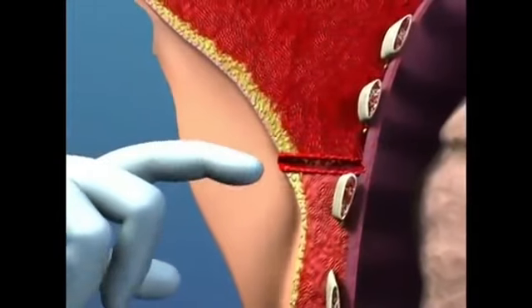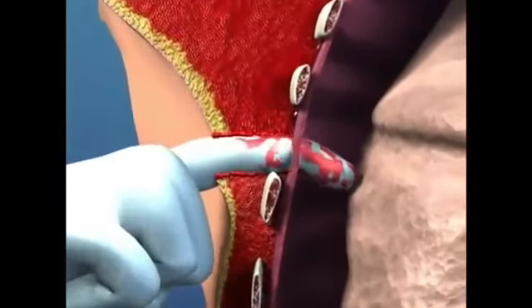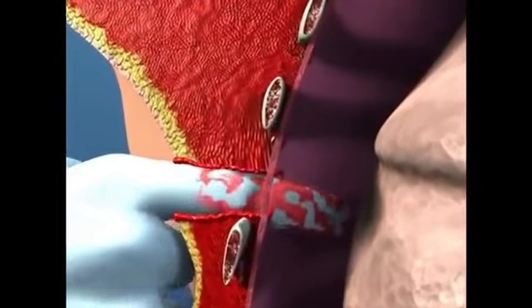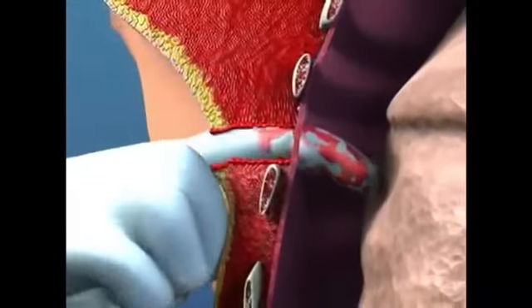Before inserting the chest tube, place your finger into the hole of the pleura. Move your finger around 360 degrees to confirm correct location in the pleural space by feeling the lung and making sure that there are no adhesions or impediments to placing the chest tube.